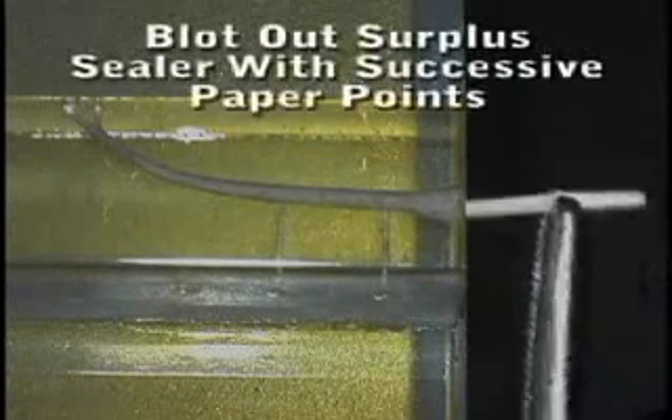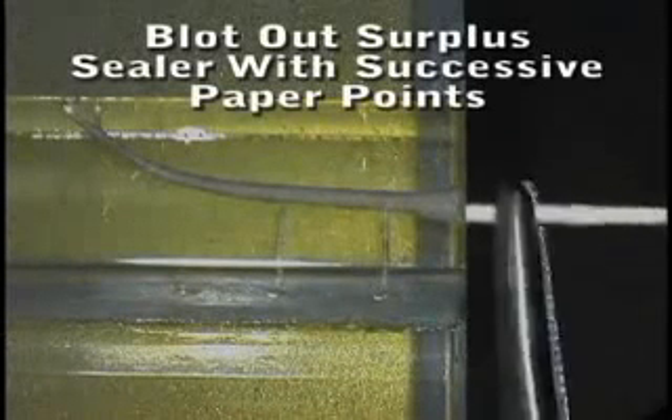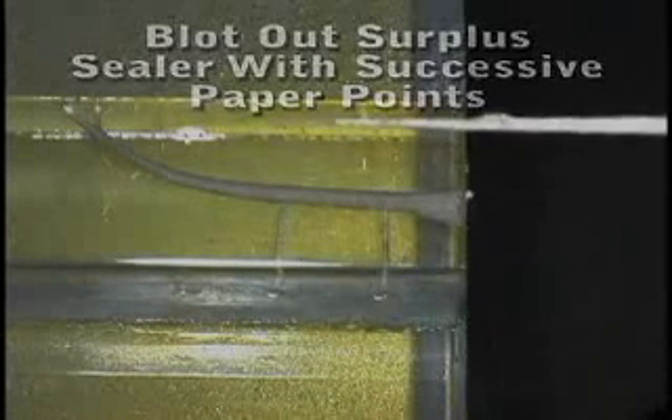The canal is dried and coated with sealer with a paper point. It's critical that you blot any surplus sealer with successive paper points until the paper point comes out spotted rather than coated with sealer. If there's too much sealer in the canal, there will be a big bolus extruded at the end of the procedure.